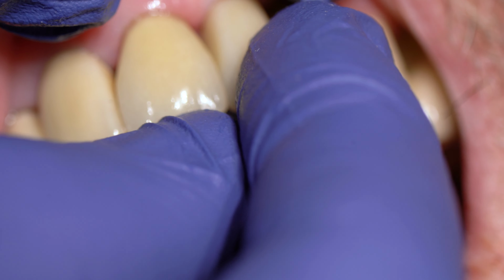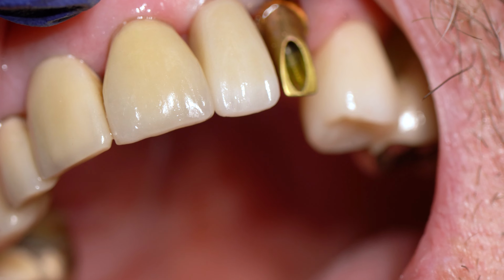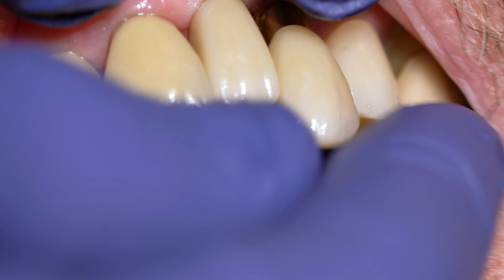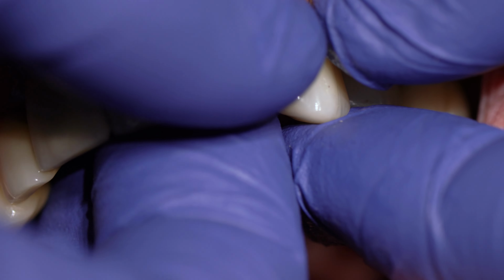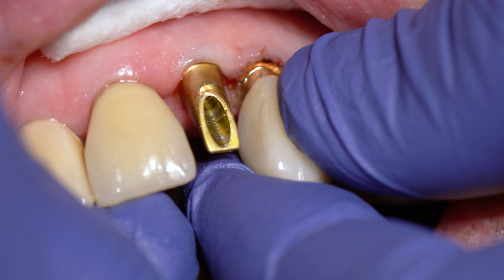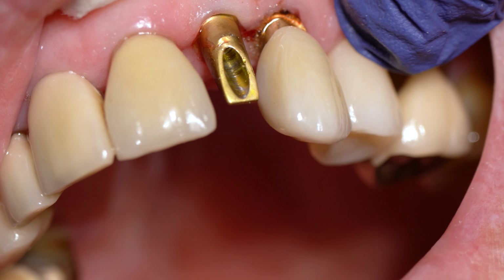Today I'm going to show you a restorative complication. We're seating number 10. See, number 10 seats down, and now we're going to try to seat number 11. And when you try to seat the canine, number 11, it's just not seating. For whatever reason, it's not seating, so I remove number 10 to make sure that there's no contact impingement, and I try to further seat number 11, but it's just not seating.